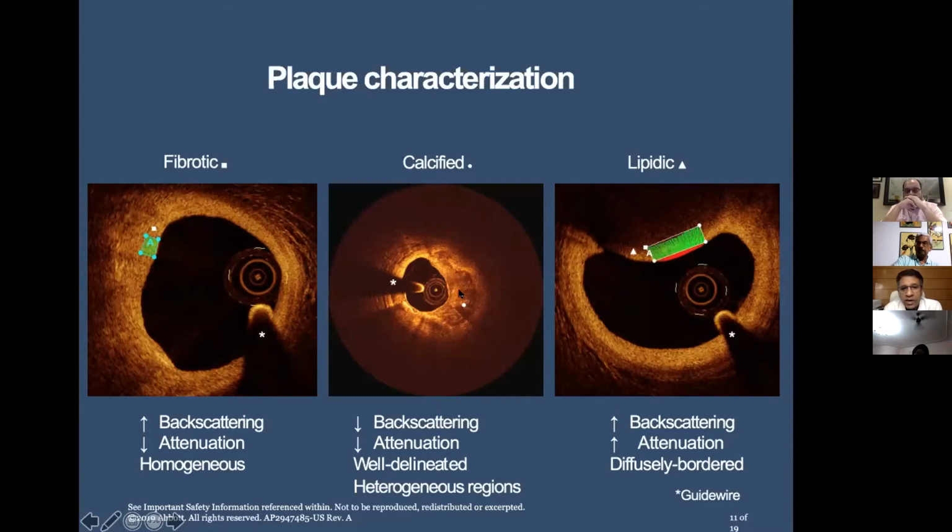And here the OCT scores very much over the IVUS, because in calcified lesions, and now with the arrival of different plaque modification tools like IVL or ROTA or orbital, it is more important for you to characterize the plaque, whether it is concentric, what is the thickness, which you cannot do with intravascular ultrasound. With OCT, you can very well define all those characteristics, which I think Dr. Balbir will describe in detail.